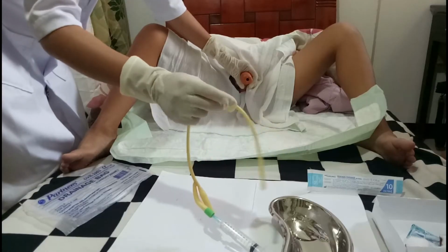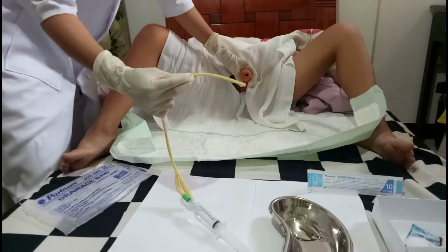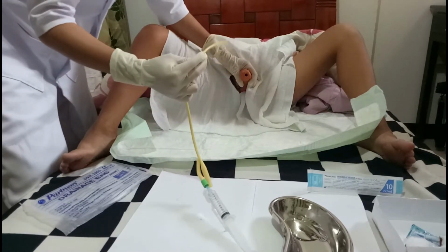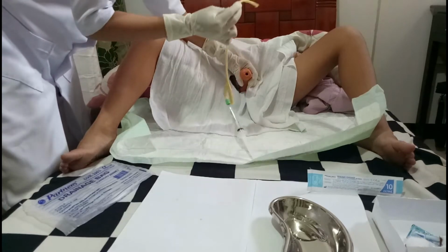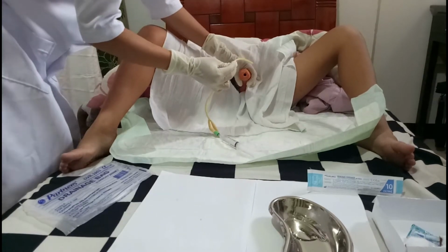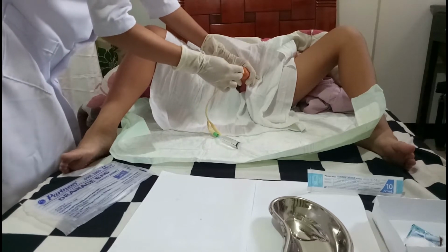So now I'm going to insert the catheter into the urethra, 6 to 9 inches or until the urine flows. And insert this one into the urethra of my male patient. So sir, breathe deeply, sir. I'm going to insert it now, okay?